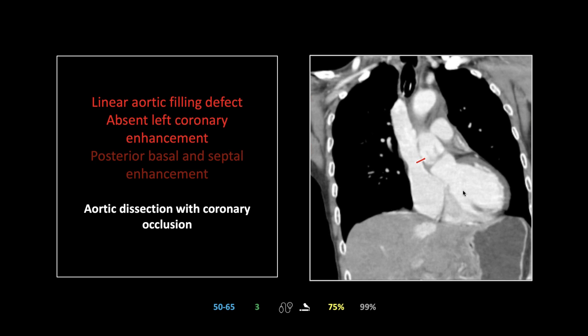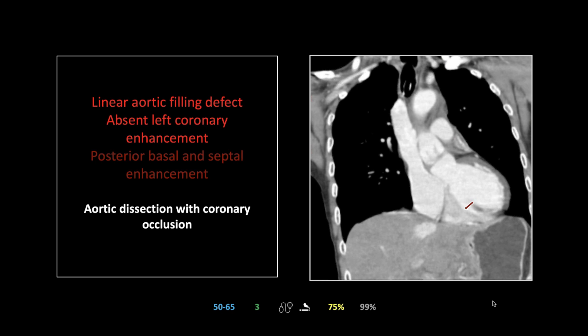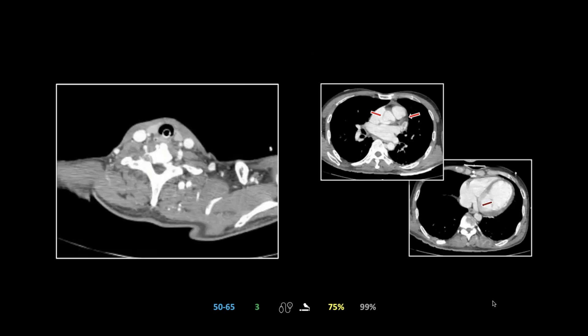The linear filling defect is much too high — it is significantly higher than the level of the valve, which is probably sitting lower. Again, note the perfusion of the normal septum and base, but the hypodense under-perfused myocardium is clearly visible, and there you can see the left coronary with no contrast within it. The posterior basal and septal enhancement is preserved.